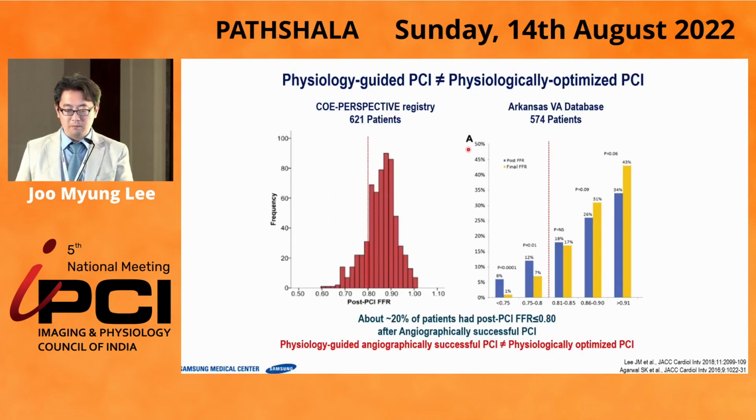And we need to remember that regardless of what index we are using, physiology-guided PCI is not the same as physiologically optimized PCI. Those registries nicely demonstrated about 20% of patients still have low post-PCI FFR even after angiographically successful PCI.